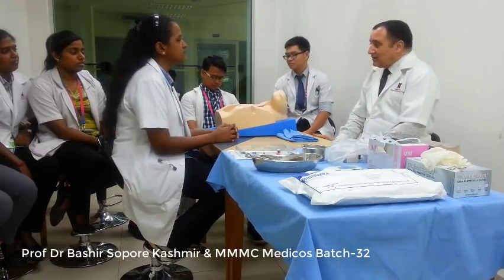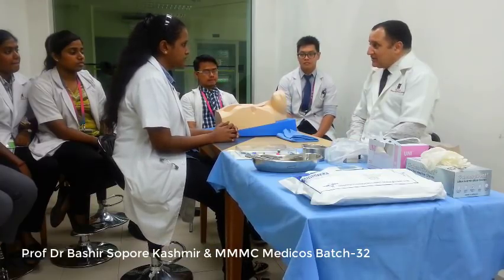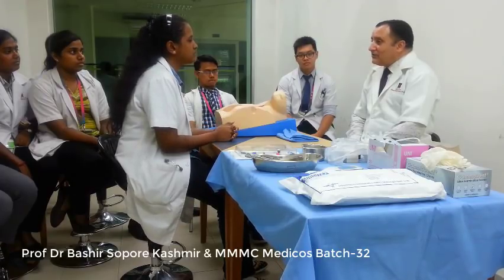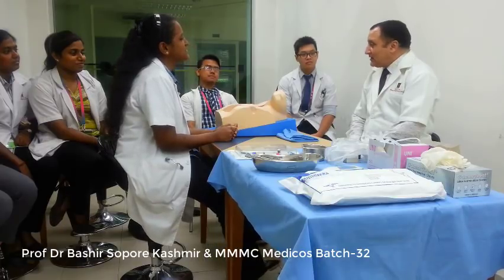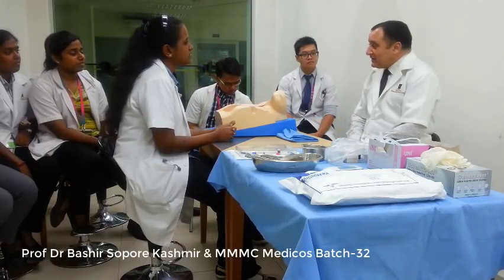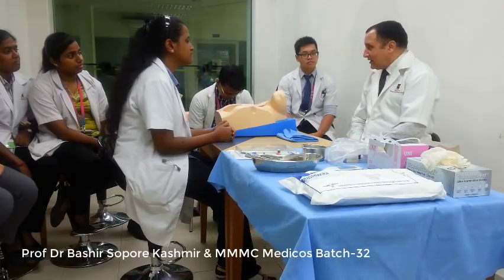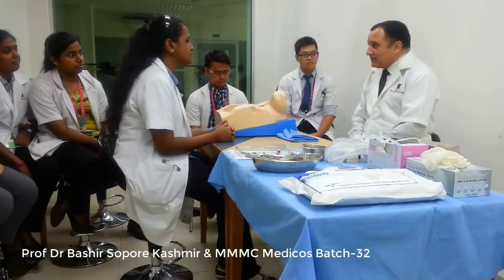We know the diameter of the internal jugular vein is around 2.5 centimeters. It is a large vein, but in cases of severe hypotension, shock, the vein may be collapsed. So it is better that we put the patient in Trendelenburg position at 15 to 30 degrees.